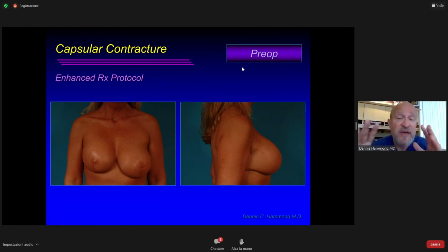Now, using this surface area-based capsule evaluation system, if you came to me and said that you did 50 breast augmentations with scissors and 50 breast augmentations with Bovie, and all of the scissors were 0 grade and all of the Bovie ones were 2 or 3 grade, I would believe you. That helps us speak in terms of the variable that's actually changing, which is the surface area of the pocket.